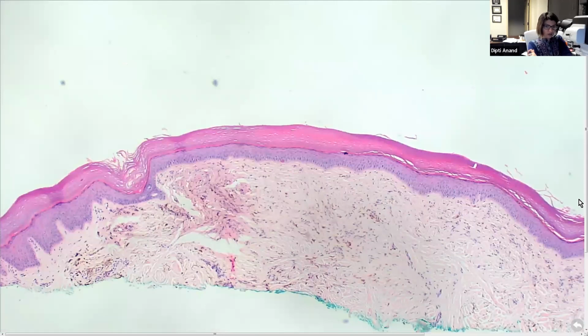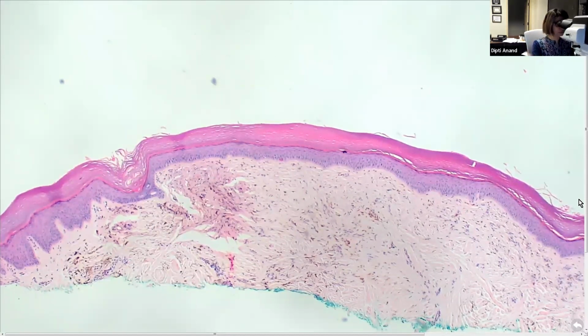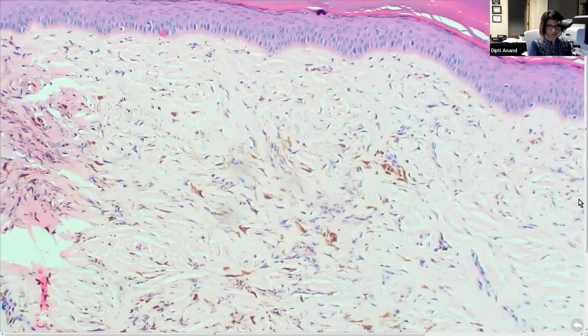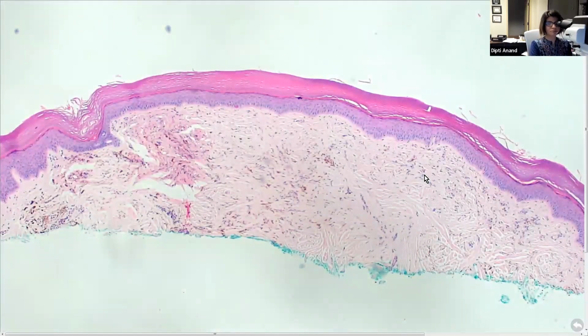Slide number 26. I want to do these after I have taught you guys the other cases, because we're going to talk about recognition of different kinds of pigments. This is an example of a blue nevus, and the main point here is to determine what kind of pigment you're looking at. So this has melanin and not hemosiderin. Hemosiderin is golden brown, it is refractile, it shines back at you, whereas this one is just brown. It's not golden brown. It's not shining back. So that's melanin pigment, along with the background proliferation of the spindle stellate dendritic cells, which is your blue nevus. Very often they will try to confuse you with a dermatofibroma. A dermatofibroma can have hemosiderin pigment, but if you see melanin pigment with background fibrosis, you will think about a blue nevus and not a dermatofibroma.